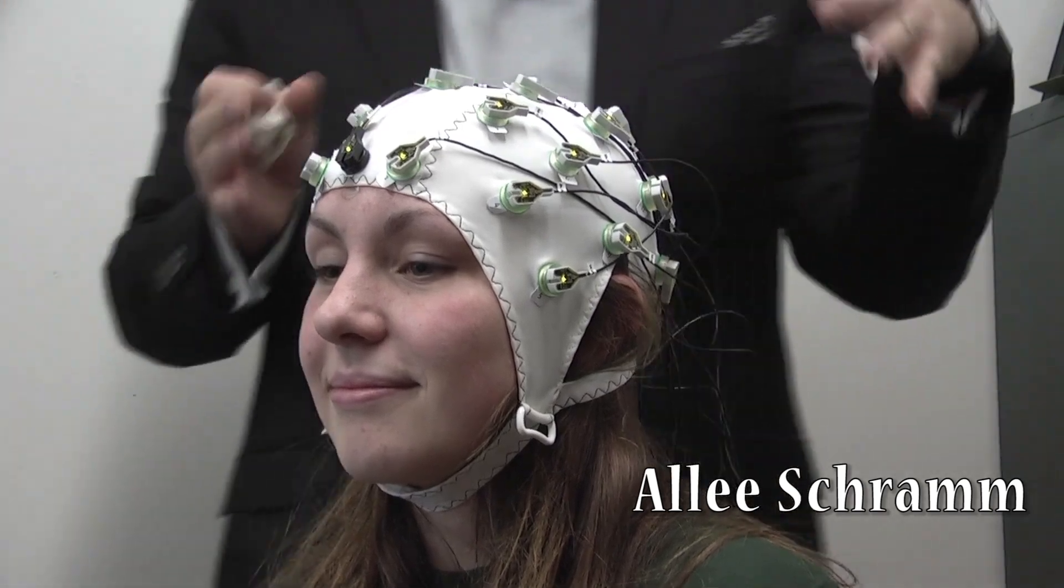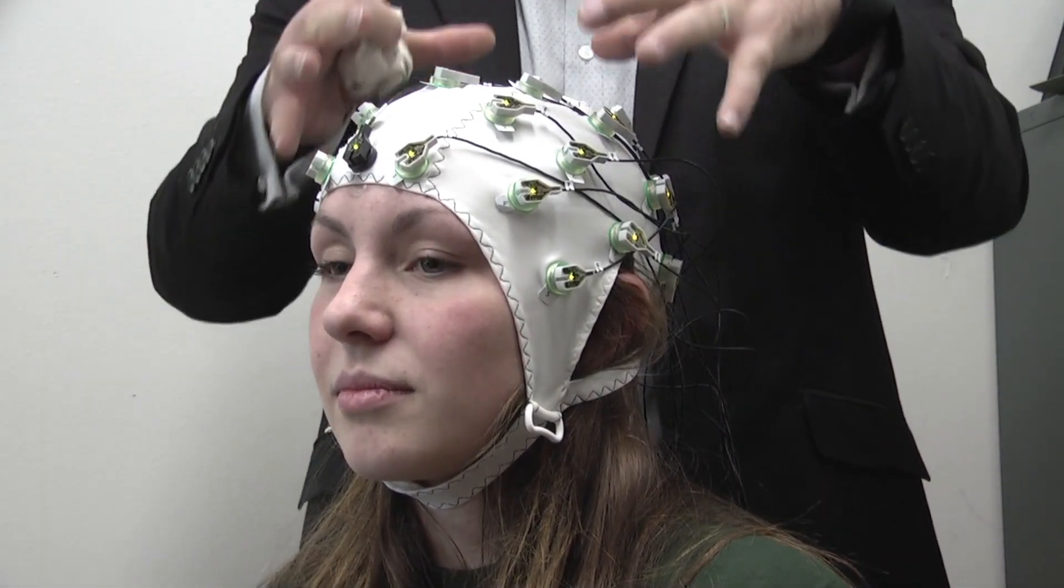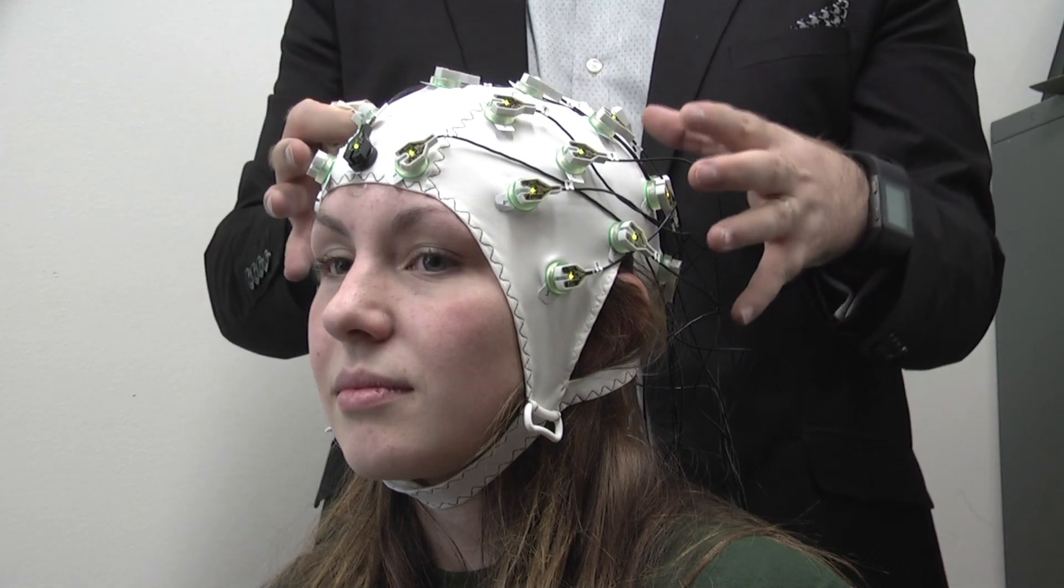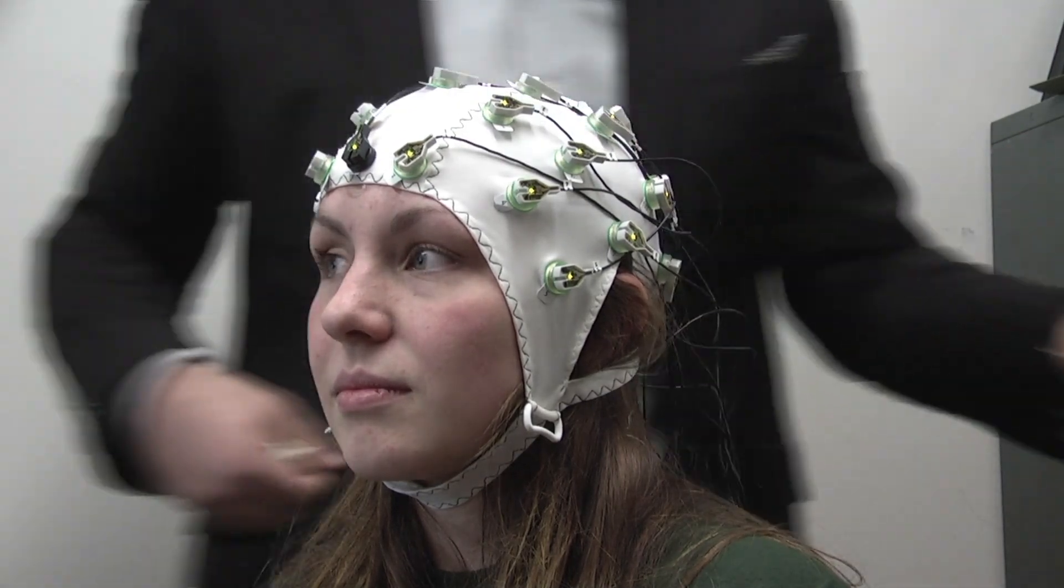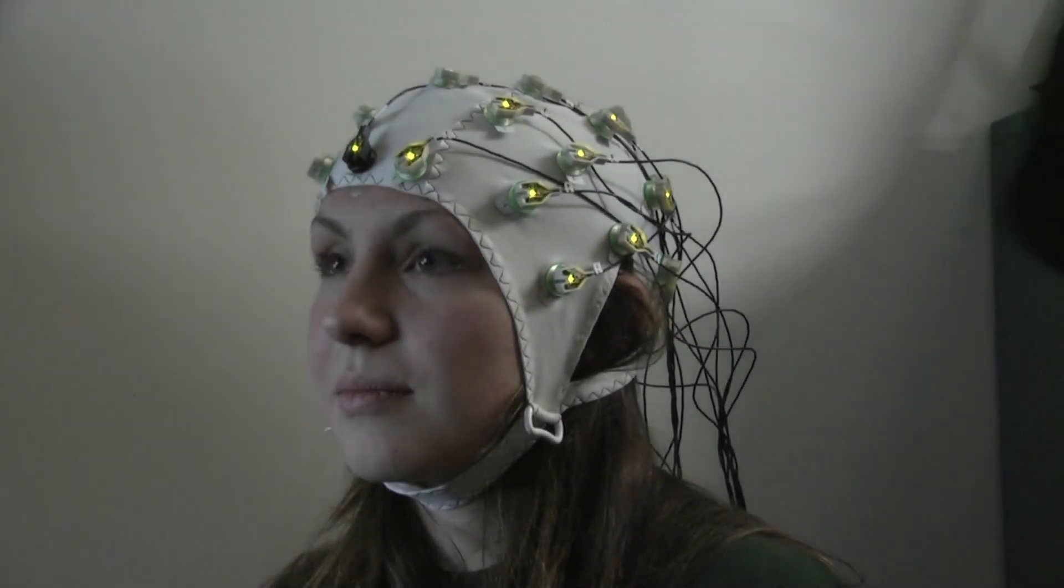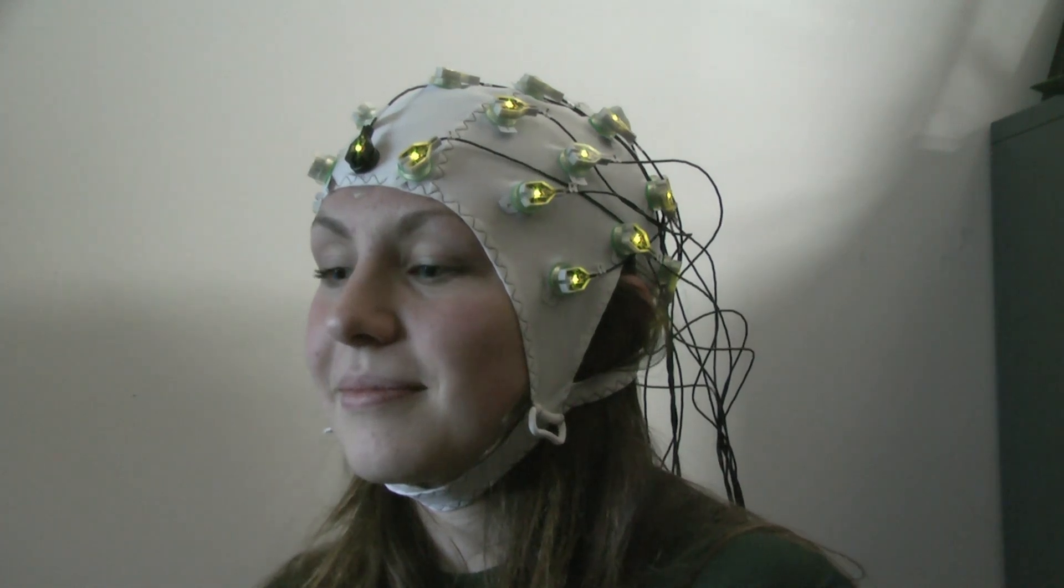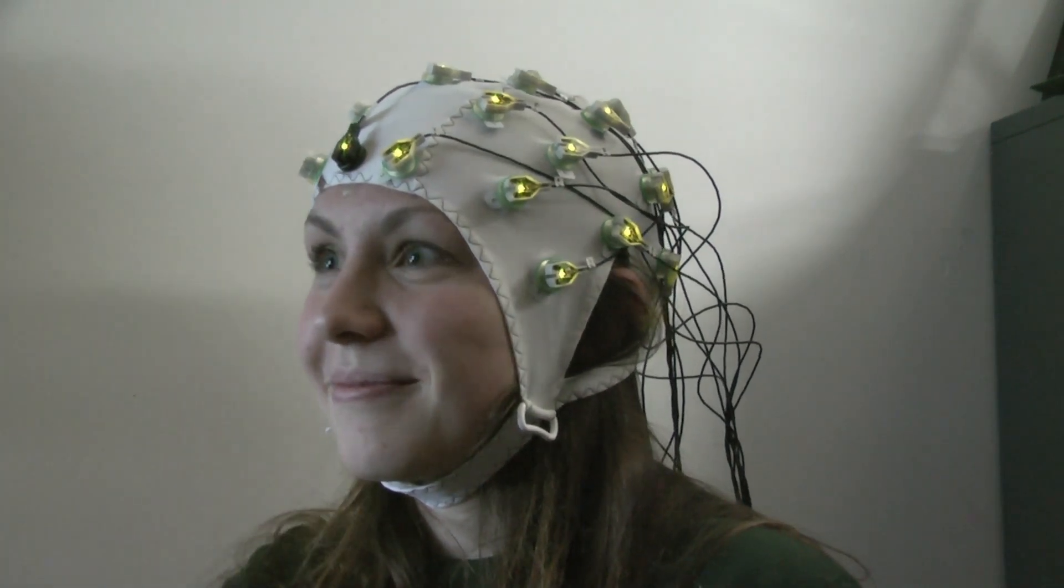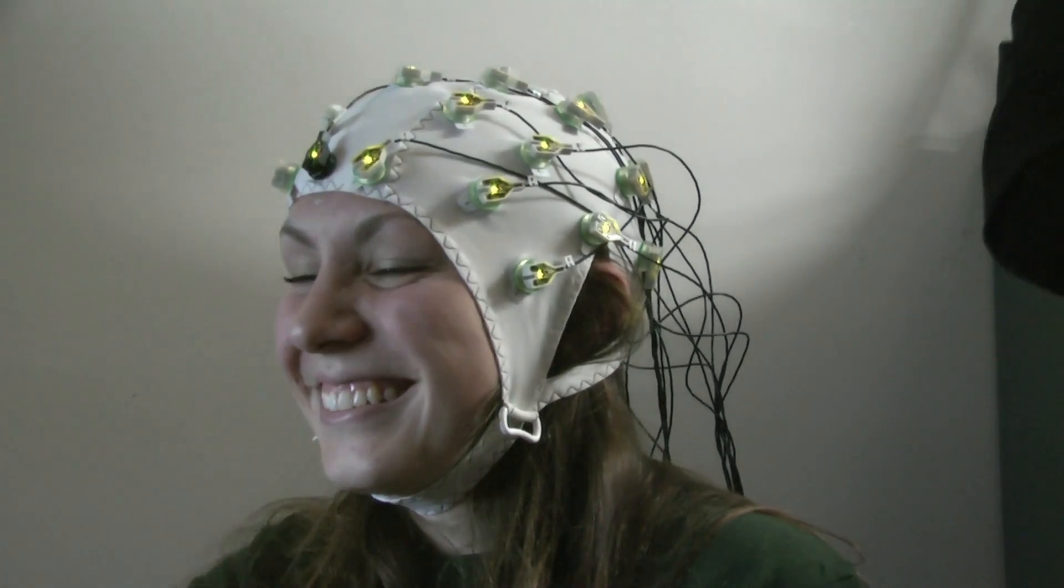What we've done, the first step in any kind of EEG, is to create a really solid signal at every single one of the electrodes. And what we're going to do now is see not just what they look like in color. We can turn off the light for a second so you can see them in multiple colors. There we go. Go ahead and grab your mirror and you can look at yourself as you're lit up.